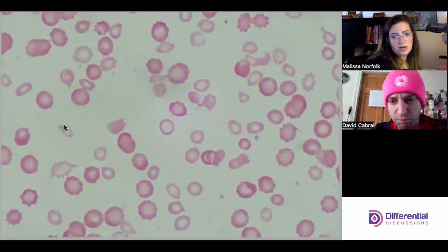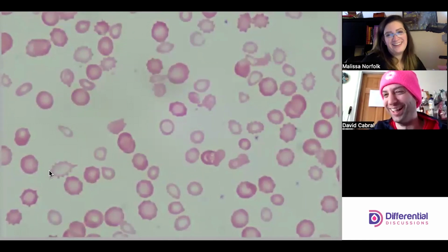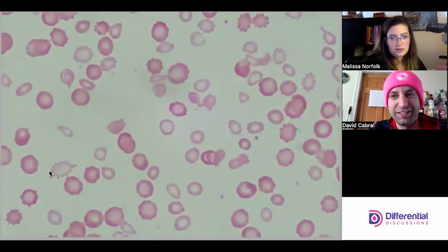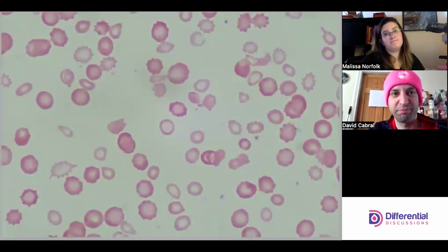But again, this is just showcasing that you have your normal, probably transfused population along with your hypochromic, microcytic, I almost said microchromic, microcytic population. Still true, probably. And it does look like there's some kind of hemolytic process happening with this too, because there are a number of cells that are reminiscent of schistocytes in here. Which would also fit with uremia. Yep, true.